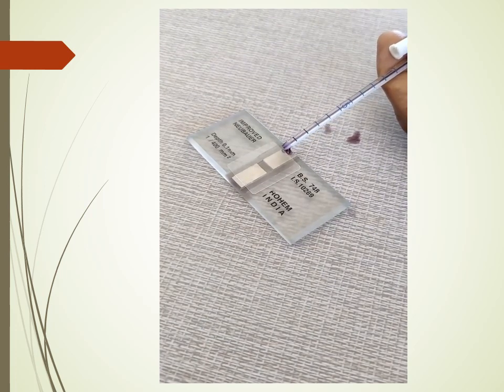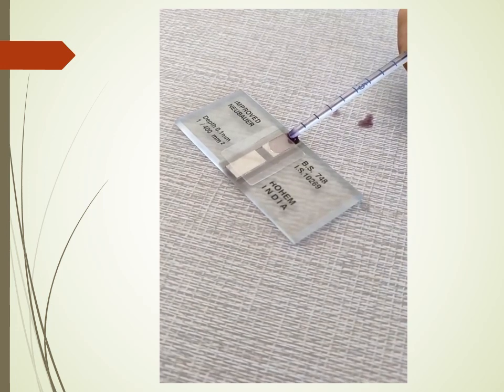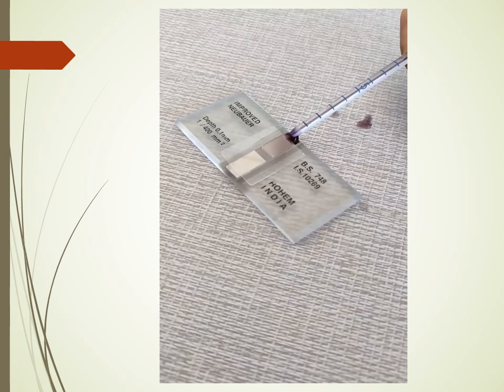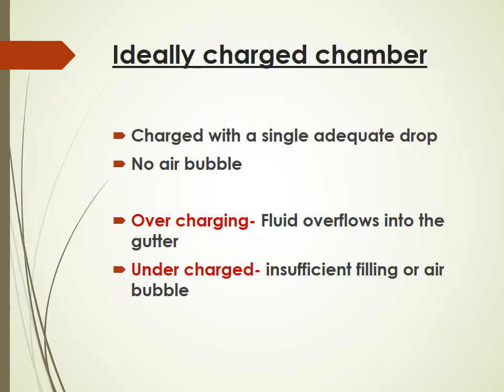Place a clean cover slip on the chamber, then charge the chamber by putting a drop of fluid just near the cover slip — the drop spreads under the cover slip by capillary action. Avoid air bubbles and fluid overflow. An ideally charged chamber has a single drop with no air bubbles; overcharging causes fluid overflow into the gutter, and undercharging results in insufficient filling or air bubbles.